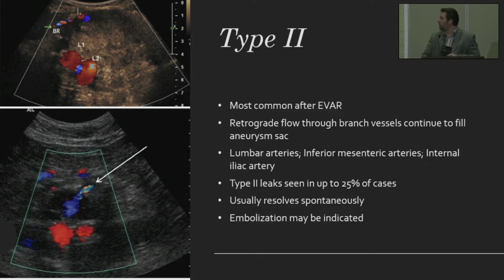But if we look, number one, if we optimize our image, and then something else that we do at the Vascular Institute is when we look at these, we look at them supine but then we also decube them to each side to look at the graft from different angles. And we've actually seen sometimes endoleaks that we weren't able to see supine that we found by rolling the patient up on their side.